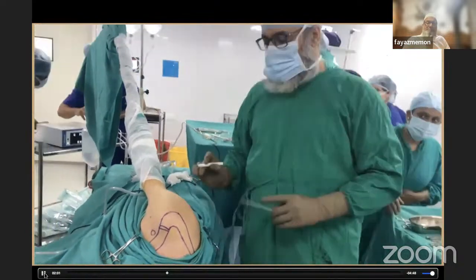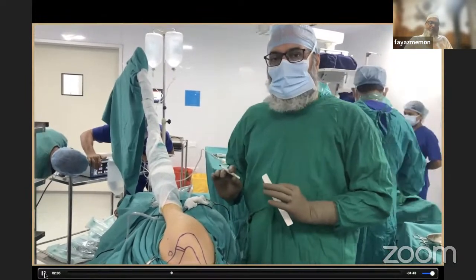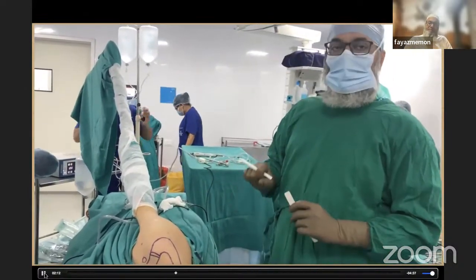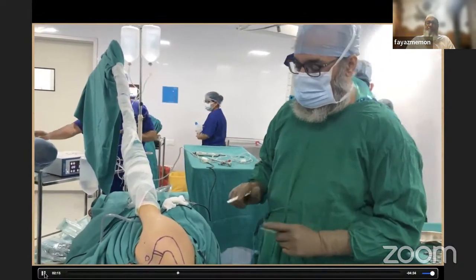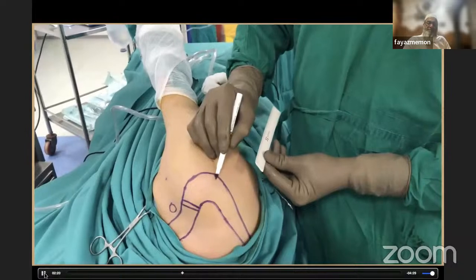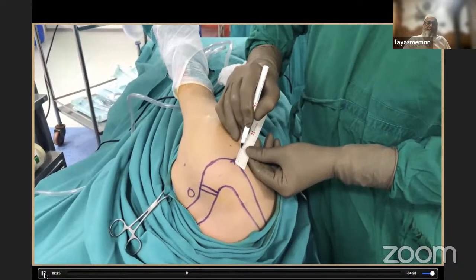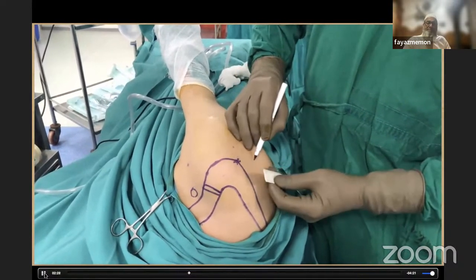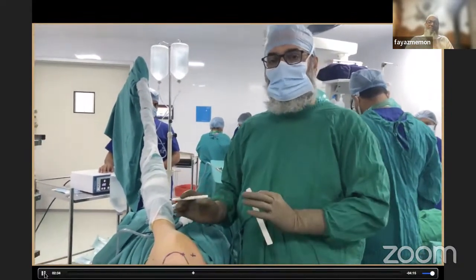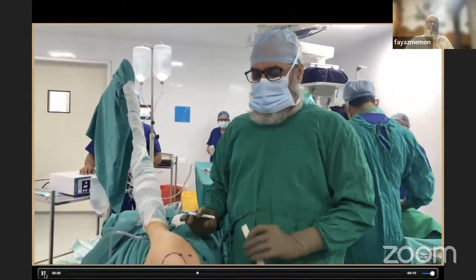Any shoulder arthroscopy, whether it is subacromial or intra-articular, always starts with the glenohumeral joint. So you have to first put the scope, the trocar and the cannula, blindly. The first portal is about 2 to 2.5 centimeters from the posterior corner of the acromion, which we marked first. So this is 2.5 centimeters down and 2.5 centimeters medially. Now this is not always the same for every patient. It depends upon acromion to acromion, scapula to scapula. But by and large, this is the marking.